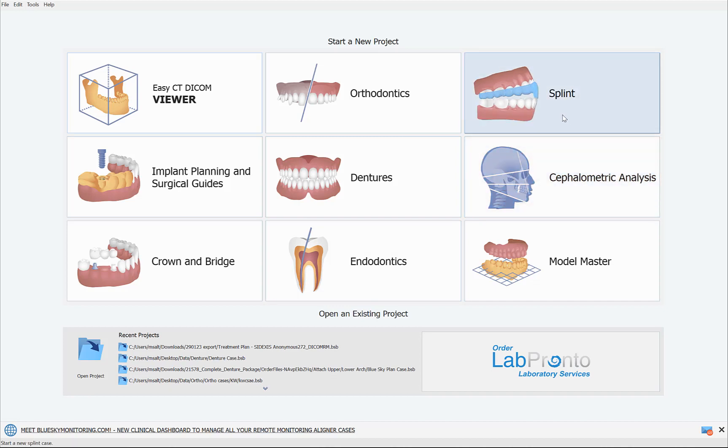The splint module allows you to create a splint. I'm going to walk you through the super simple process. The current export fee is half of an export per jaw, so it's quick, it's inexpensive, and you get your splint done. The splint module is also our first module with an upgraded user interface, so you'll be able to see that as we go through the tutorial.